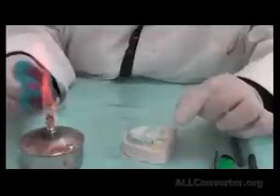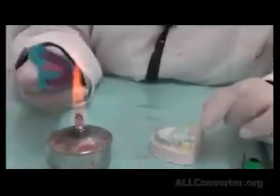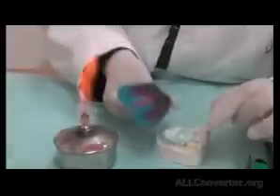So I heat it. This is the final heat. Heating is shiny. I place it in warm water and then go into the patient's mouth and put it into place and squeeze.